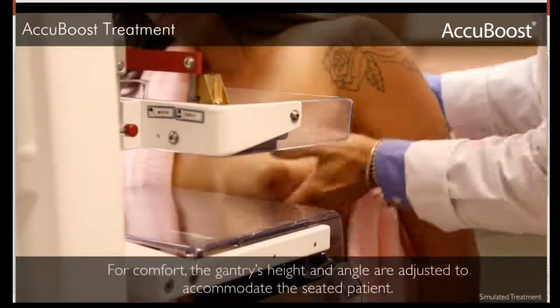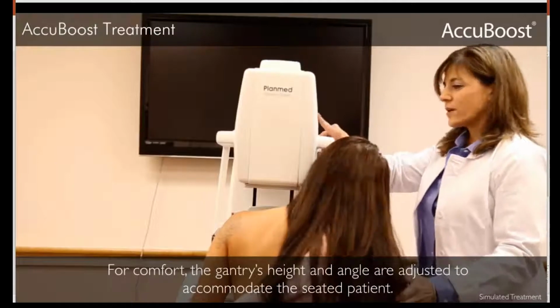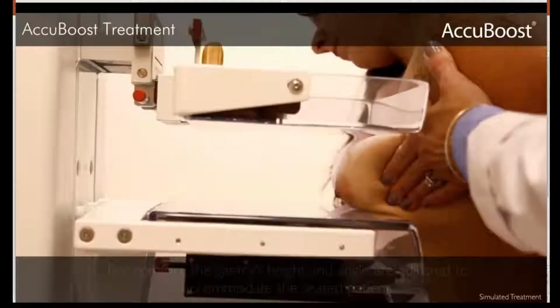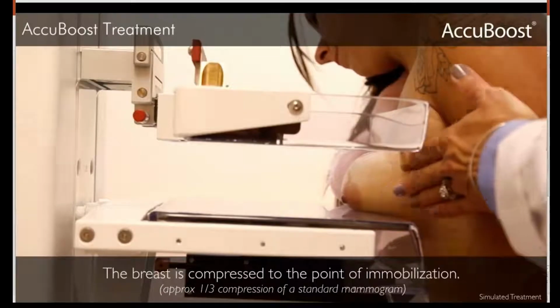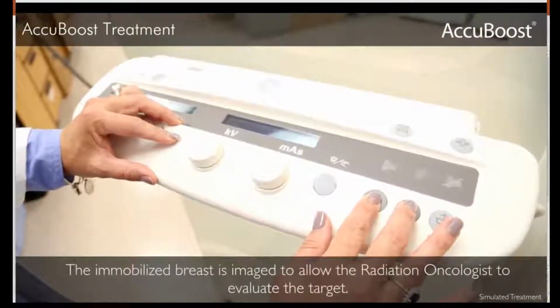She has the breast placed on the mammographic plates. There's a gentle compression of the breast. We don't need to compress the breast to the same extent as diagnostic mammogram is done. We don't want to have pain or discomfort, so it's a fairly gentle compression.